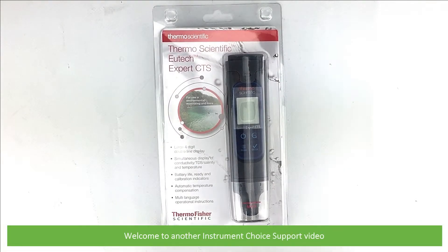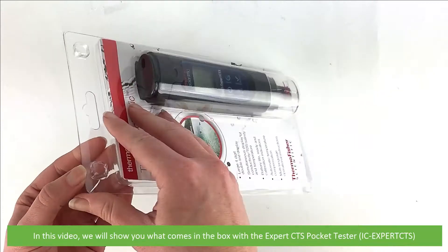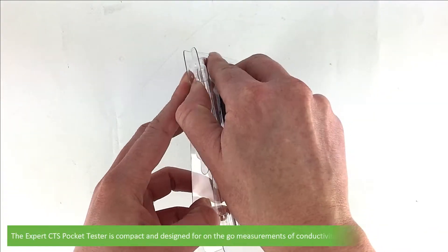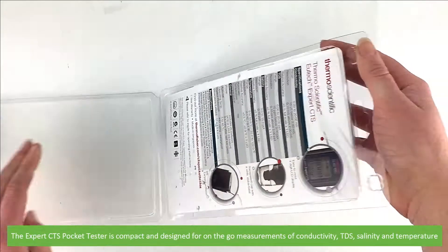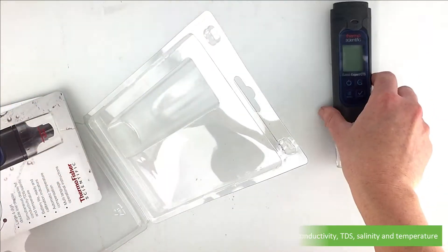Hi and welcome to another Instrument Choice support video. In this video we'll show you what comes in the box with the Expert CTS Pocket Tester. The Expert CTS Pocket Tester is compact and designed for on-the-go measurements of conductivity, TDS, salinity and temperature.